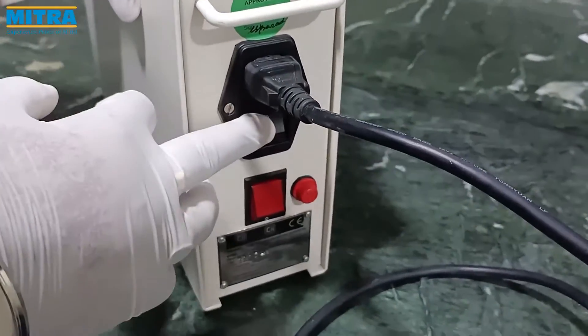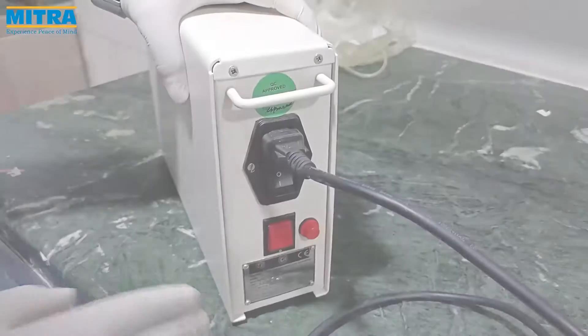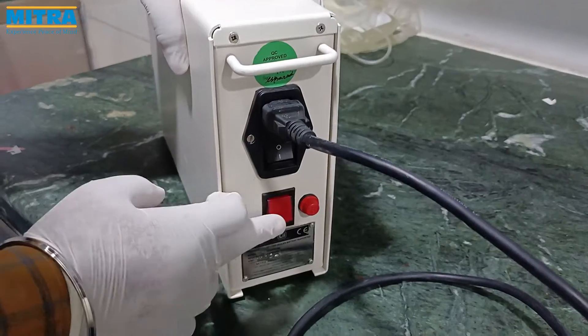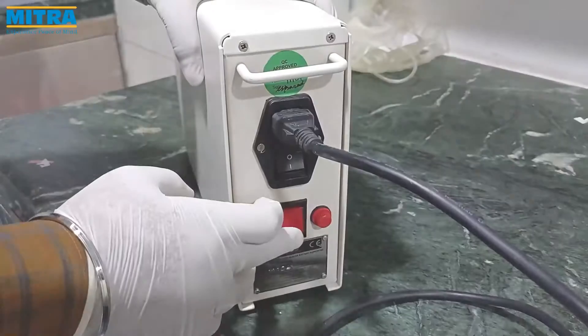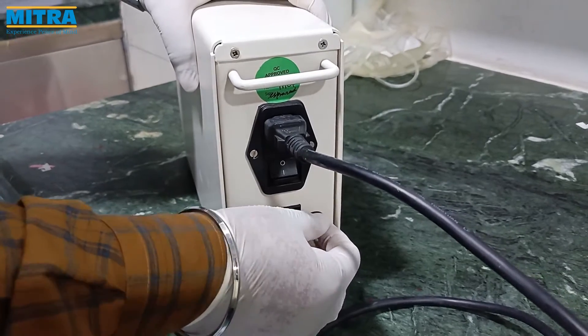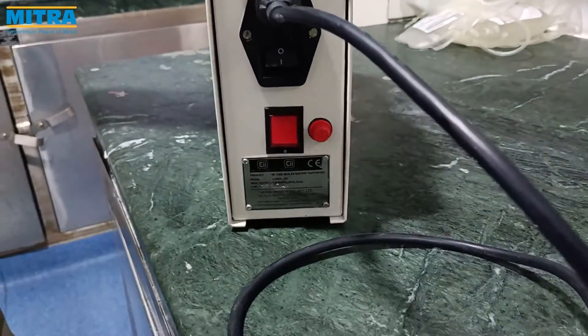The black switch below the power socket is to run it on direct current. The red switch is to power on the device in battery mode. This is the surge protection fuse, with the device information plate just below.